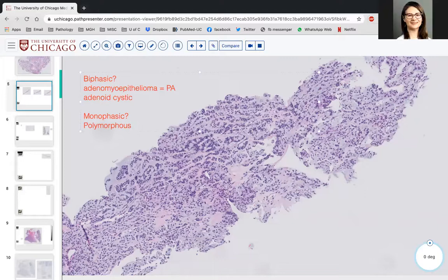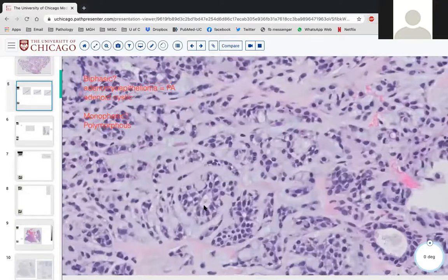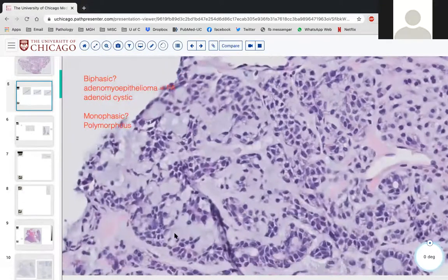So I have a type of MEC in the comment. I assume you mean mucinous mucoepidermoid carcinoma. Yes. Do you see any intracellular mucin? I saw kind of clear cells, but I'm not sure if they are myoepithelial cells. The cells appear clear, the cytoplasm is clear, and it is cytoplasmic. But myoepithelial cells could be clear as well.